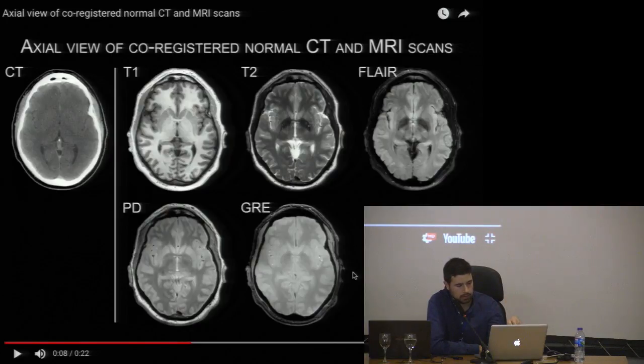And that is why MRI, as a kind of structural analysis, is not only one kind of image, as would be the case for computed tomography, which in reality is not, but it's much easier to explain this way. But you can get different kinds of images depending on how you tune the machine to work.